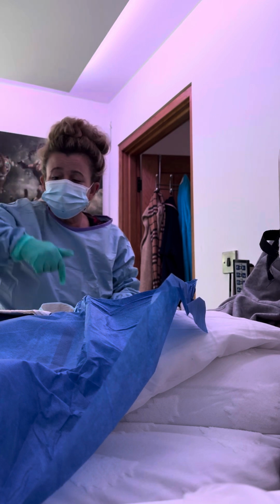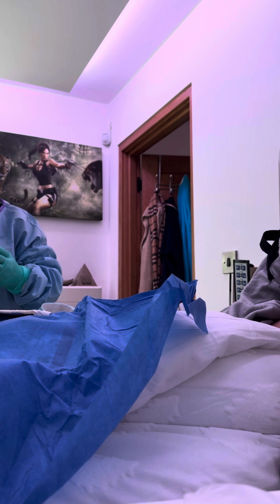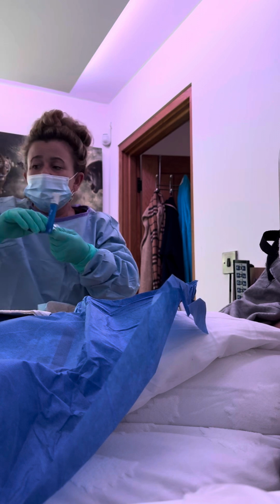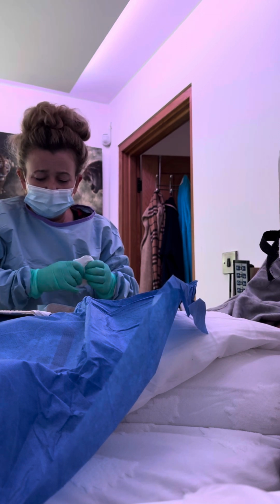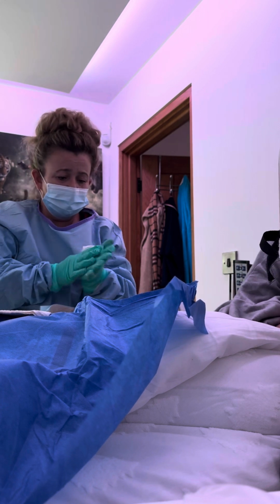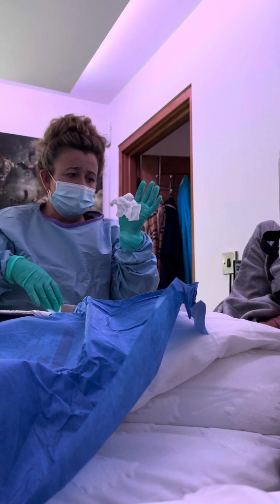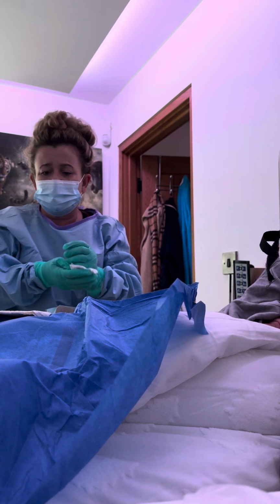So what I've done already is I've put some instillagel down there. I'm going to pull my mask down because I can't handle it. Just as long as my spit doesn't go in there, I'm not really bothered. I'm going to use a clinical wipe on my hands and see if I can get this done quickly, because it keeps going up and down. AD is up, down, 166, 118, 170. It hasn't gone any further than that, but I don't want it to.